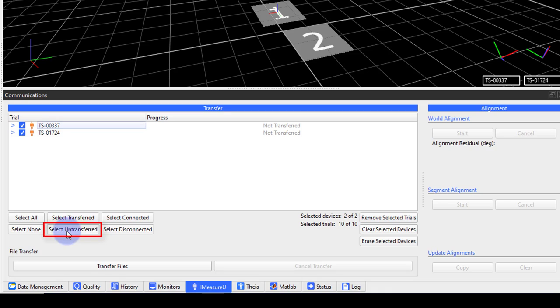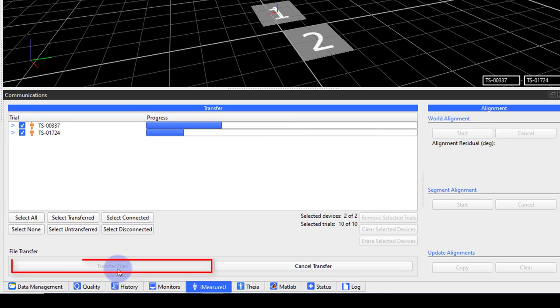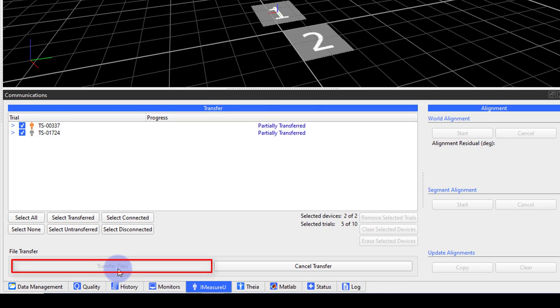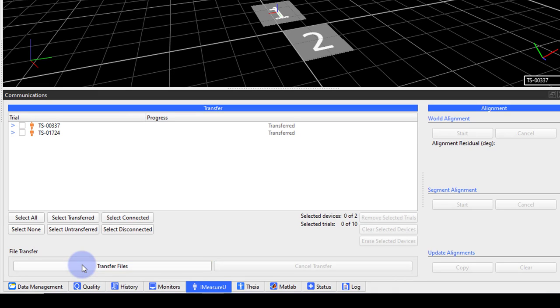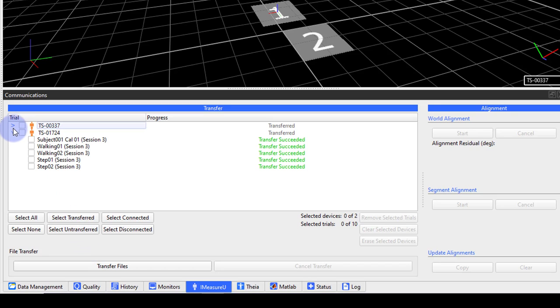Click select untransferred to select all the untransferred files, then transfer files. When I expand the sensors again, I can see that all trials have been transferred successfully.